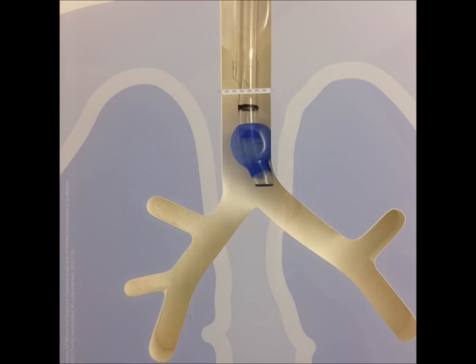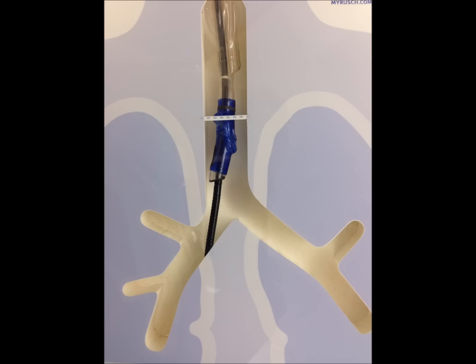In the very rare instances where you actually want to use the right-sided endobronchial tube, go down the endobronchial port, visualize the carina, and make sure the bronchoscope moves into the right bronchus. Then you can thread the tube over that way. But because this is such a short segment before the takeoff of the right upper lobe, it's very easy to either block this lobe completely — ventilating only two lobes — so you'll see that perfect placement, and minor movements can cause sometimes major problems.